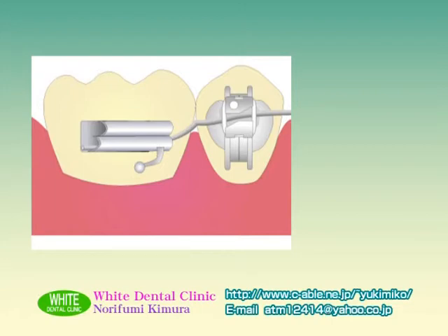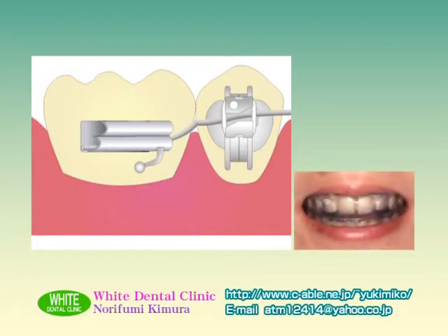A slight clearance between both premolars allows elimination of torsion and alignment. This is because the premolars can be treated orthodontically at the early stage, as well as occlusion correction during retention with a pre-finisher. If crowding of the premolars is confirmed at initiation of orthodontic treatment, intrusion or extrusion can begin. The occlusion can be corrected at the final stage.